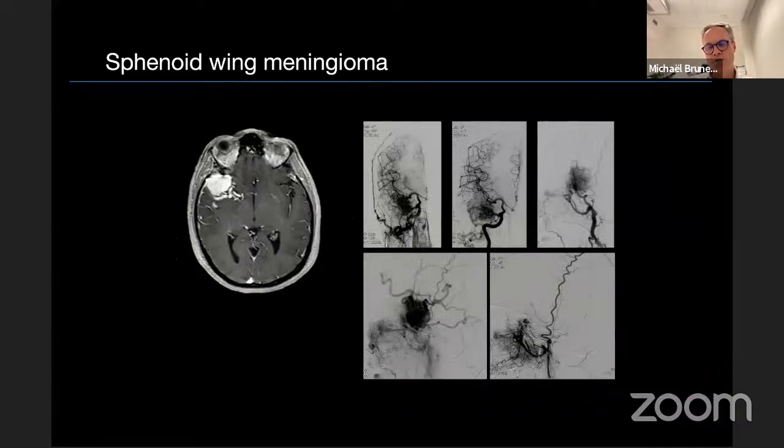And I would like to discuss with you some more difficult lesions. This tumor looks very convenient, a small tumor, but in fact it was highly vascularized. You can see that the surrounding venous vessels are very impressive. I would say this was a nightmare, and just making the bone opening resulted in very massive bleeding.